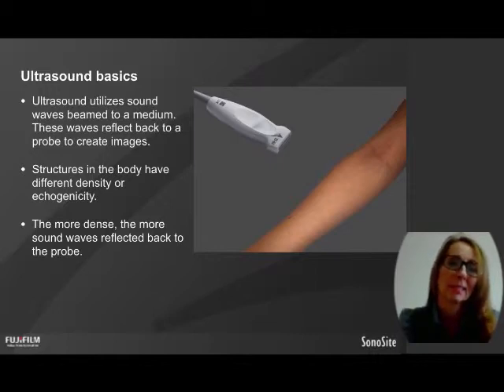Okay, ultrasound basics. So I'm not going to go too in depth. I really feel that for dialysis nurses, we don't need to know a lot about the physics behind the ultrasound machine. I would always recommend in a dialysis setting, for straightforward assessment and cannulation, that we stick to very straightforward portable ultrasounds with minimal knobs and buttons, because I do find that it really puts the nurses off.